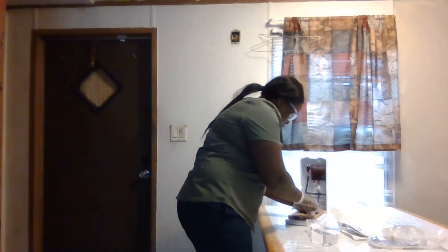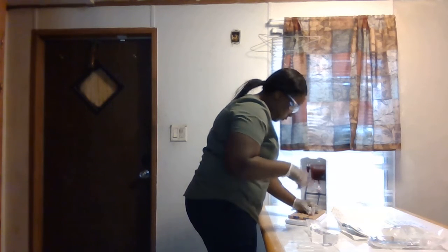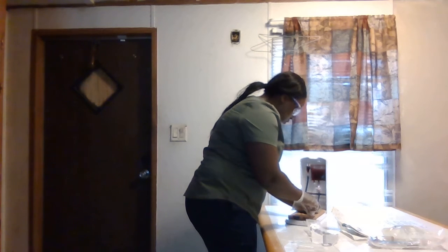now I can go ahead and attach my extension. Again, very serious, whenever you're ready to attach the syringe, the extension port, you have to do it quickly. Alright, so quickly, and it's attached.